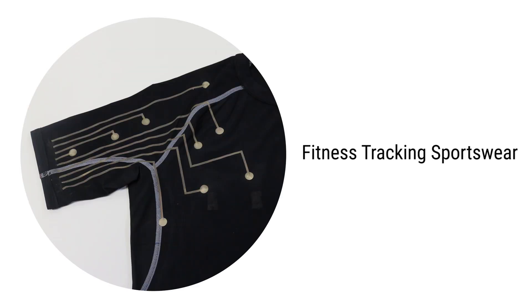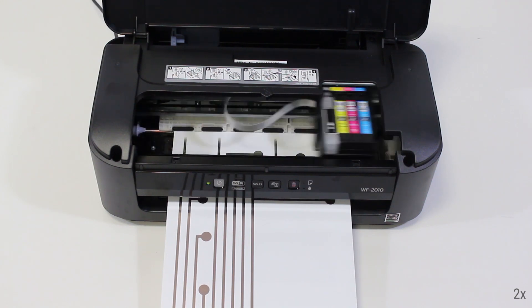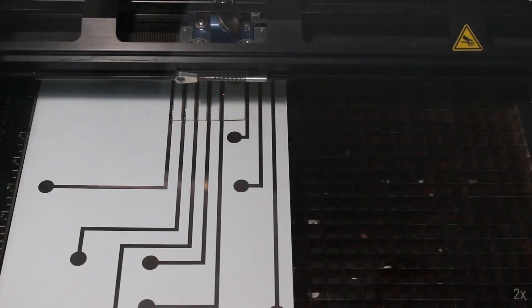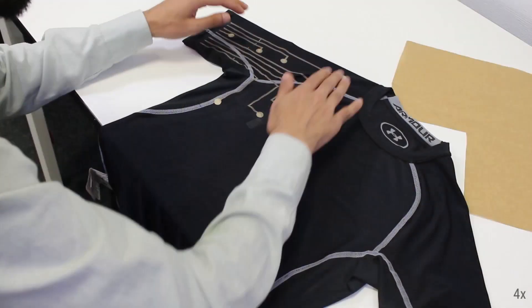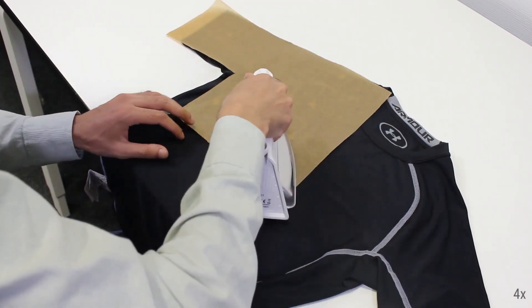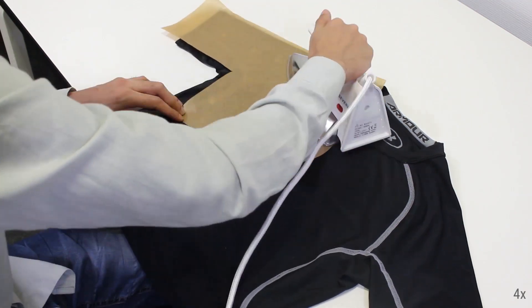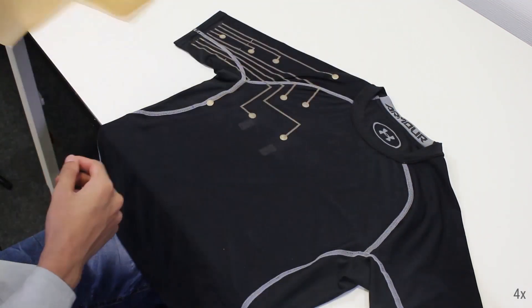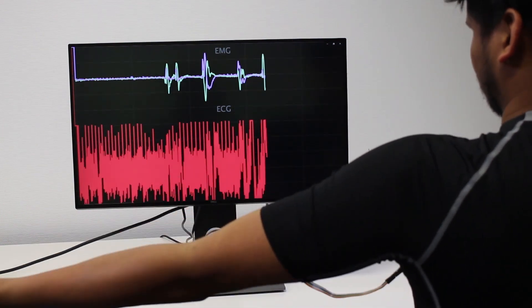We now present in detail the fabrication of our three example applications. First, the design is printed on a textile transfer film. The excessive film is then removed using a laser cutter with a negative mask of the design. The electrodes are then transferred using an iron. The sportswear can then be worn for heart rate and muscle activity monitoring.